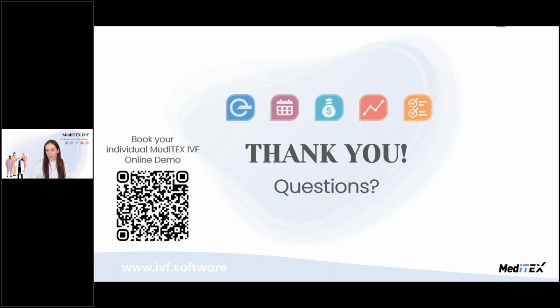Okay. So again, if you have any specific questions regarding how you work, if it's possible to adapt your workflows to MedITEX IVF, or if you think, is this even feasible the way we work, I would really suggest to schedule a meeting with me. Just scan the QR code. I'm pretty free the next weeks, and I would be very happy to show you around the system and to also answer your specific questions.